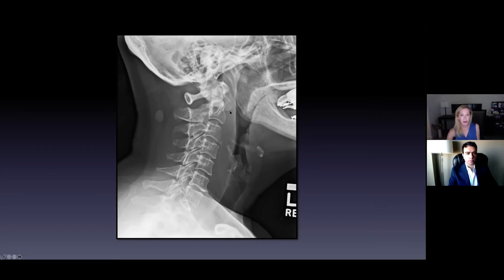This is a lateral view of the cervical spine. When we look at these, we look at spinal alignment — everything's lined up, normal alignment. We look at the height of the vertebral bodies and the disc space height. All those things are normal in this case, but one thing that's abnormal is the soft tissues in front of the cervical spine. You should not really be able to notice those; they should be pretty close to the cervical spine. So something is wrong here.